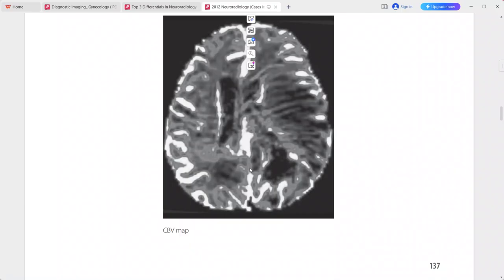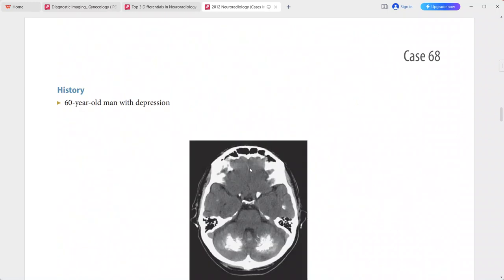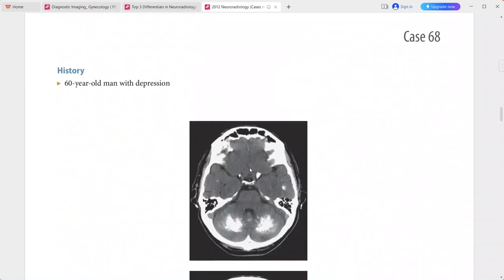Differentials include abscess, metastasis, tumefactive demyelination, lymphoma, and radiation necrosis.